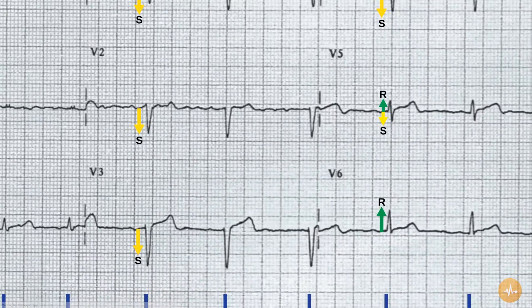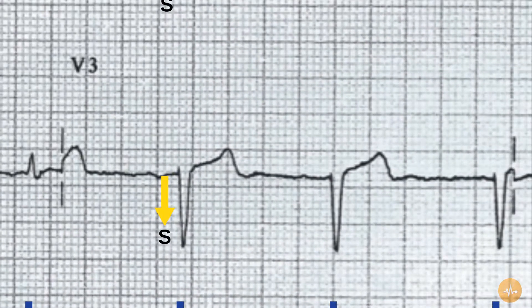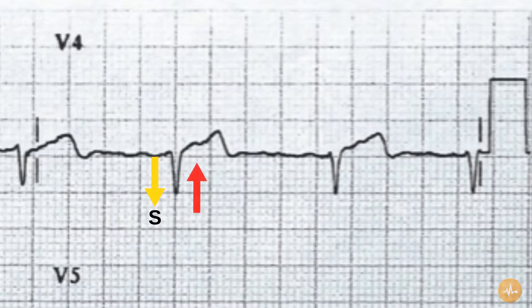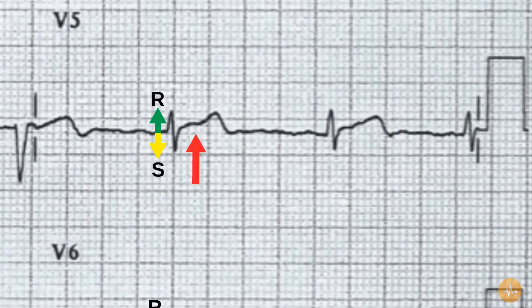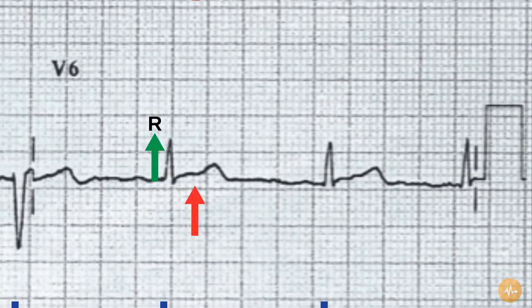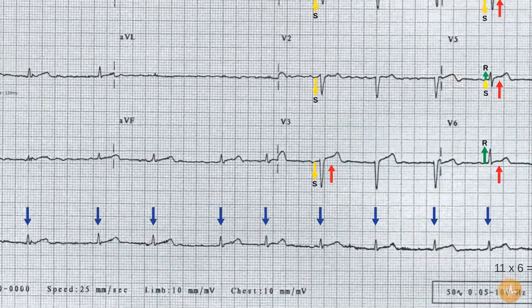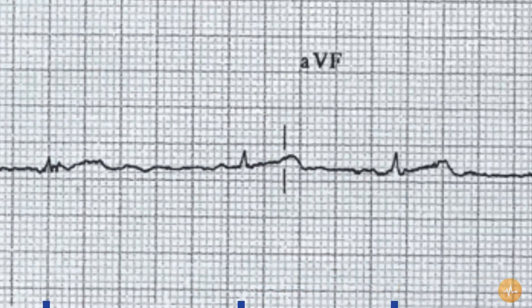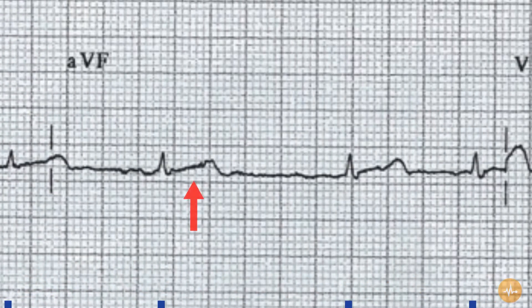There is ST segment elevation present in leads V3, V4, V5, and V6, and also probably in leads 3 and AVF, although the irregular baseline makes it difficult to see.